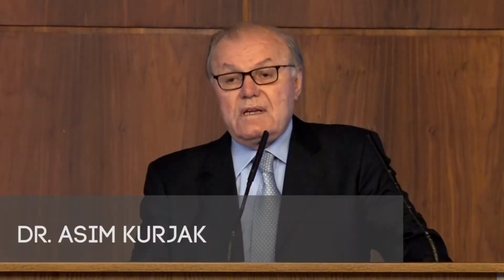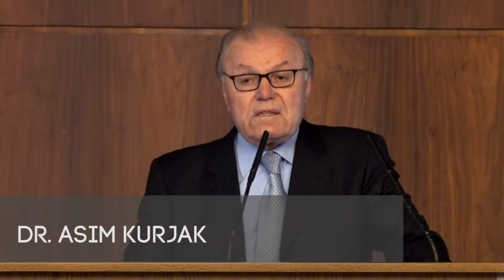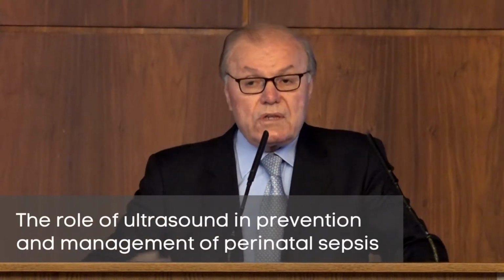How does ultrasound help? Ultrasound in the meantime became the most useful single method we have in both obstetrics and gynecology. So we have non-specific findings like hydrocephaly, microcephaly, ventriculomegaly, non-immune hydrops, and cardiothoracic lesions, and we have specific findings which will help us to diagnose certain syndromes so elegantly described by Roberto Romero. I will not go into most of these because the paper was produced when the information was that it could last 30 minutes. Now I will finish within 20 minutes.